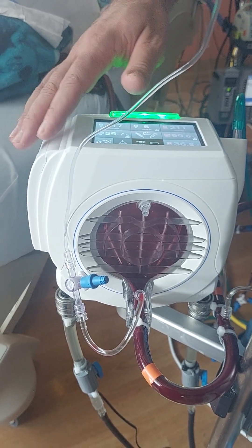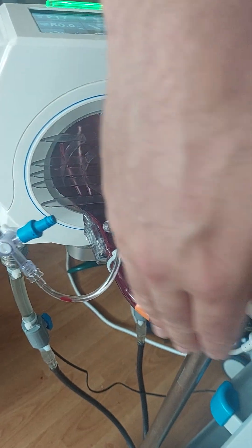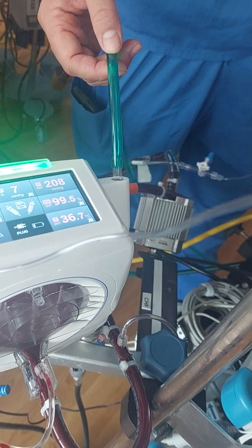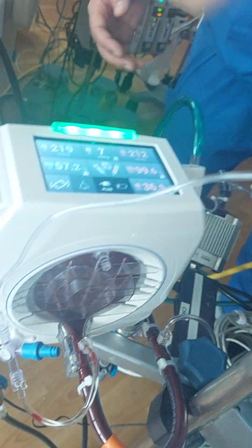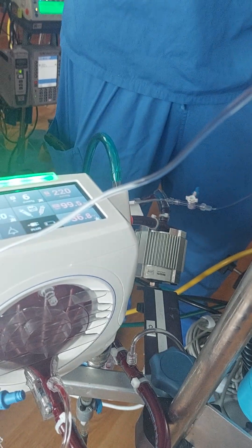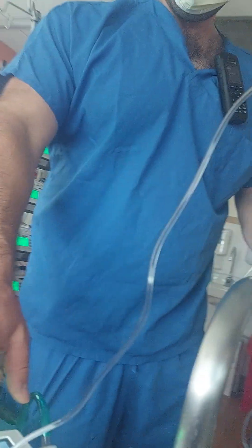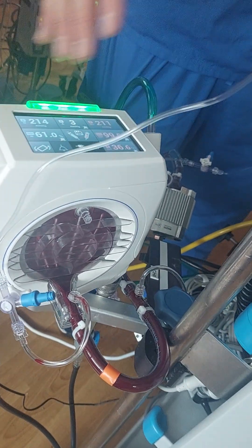As the patient's venous return gets pushed across the pump and displaced into the membrane, it enters where it meets our gas — that's the source of oxygenation. This gas line is called sweep gas, which is a combination of gas flow and oxygen concentration. As blood flows in transversely, the gas flow runs counter-current. Inside the membrane there are tiny polymethyl pentene hollow fiber filaments — very similar to CRT filaments — except rather than clearing solutes or debris, these fibers are purely for gas exchange.